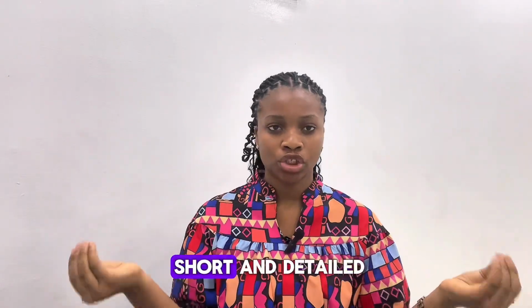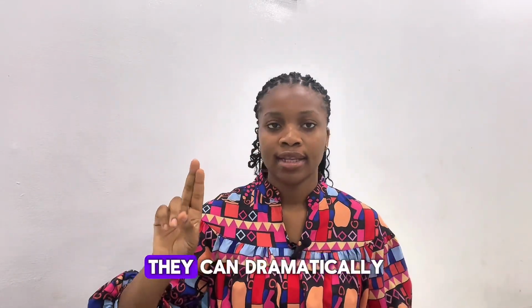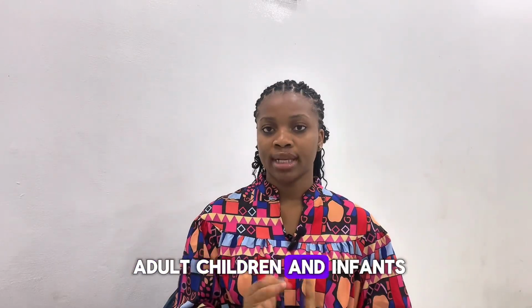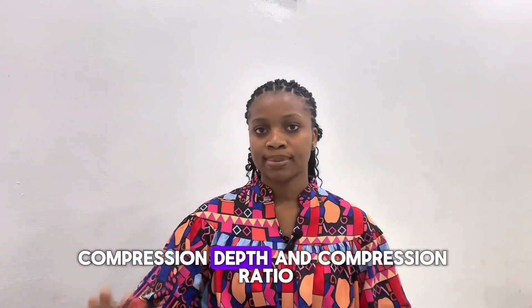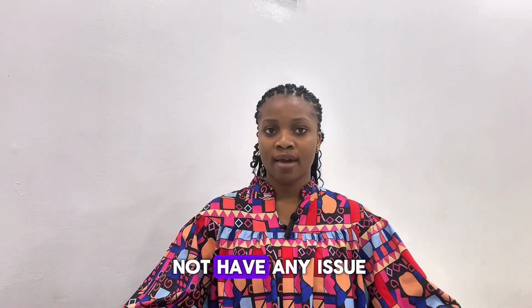This was very short and detailed. So like I said, CPR and AED, when they are used together, can dramatically improve the survival rate of the person you're trying to save. For adults, children and infants, make sure you use the correct hand placement, compression depth, and compression ratio. This AED is very easy to use. All you need to do is to follow the prompt appropriately, and then you will not have any issue.